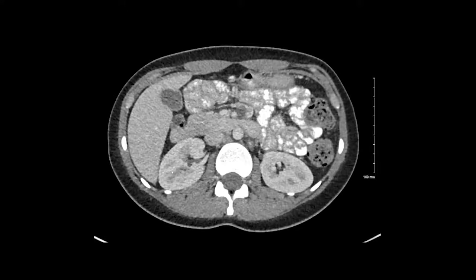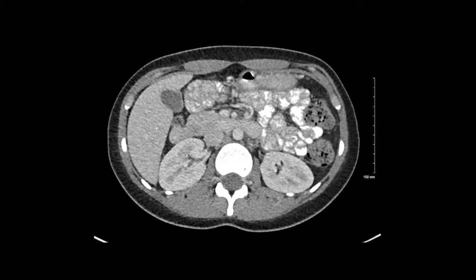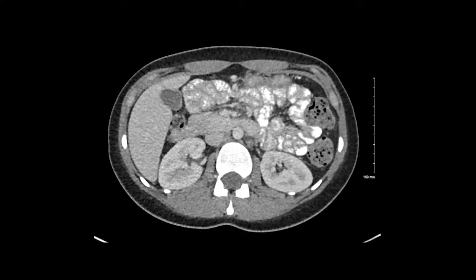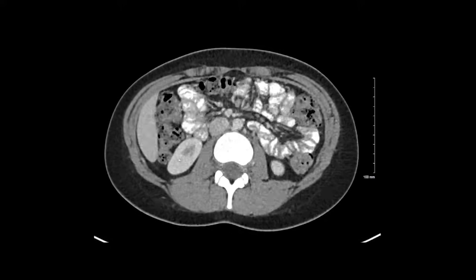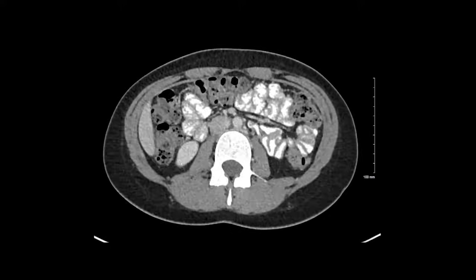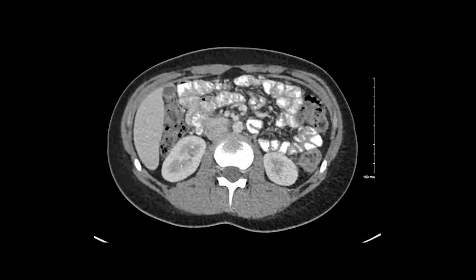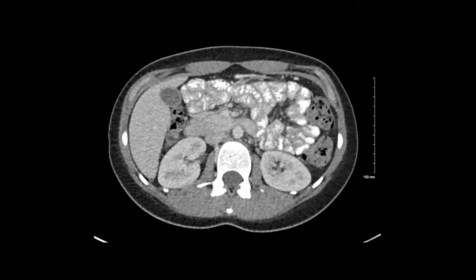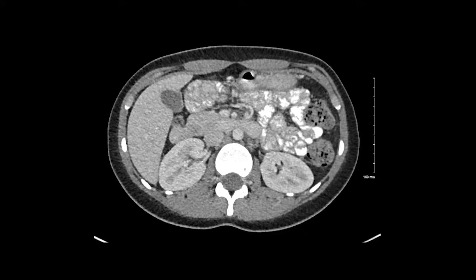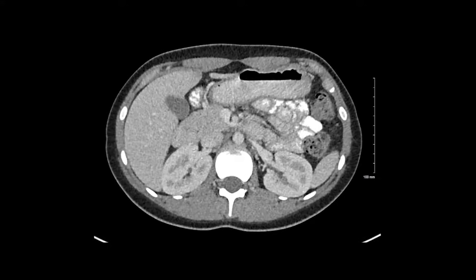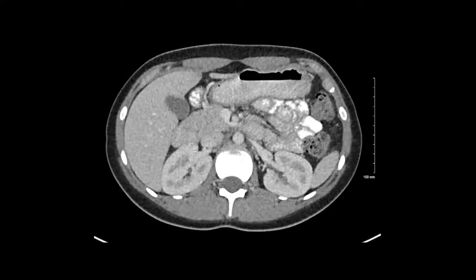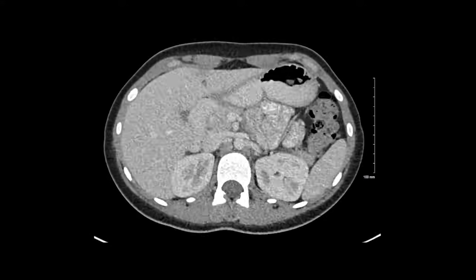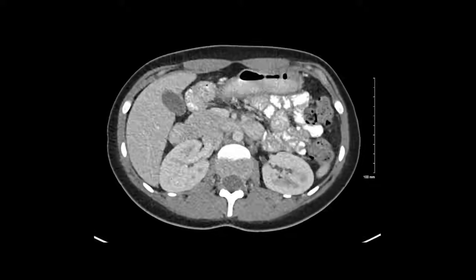In the kidneys, I'm looking for normal cortical medullary differentiation. I'm looking for evidence of cysts, nodules, or masses. I'm looking at the collecting system for any evidence of hydronephrosis, and I'm going to do that for both the right and left kidney.